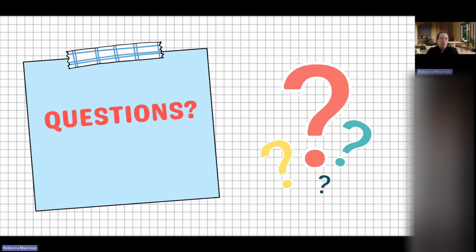Okay. Does that make sense? Yes, thank you. I know sometimes the doctor asks, what is QTC? It's like, oh, that is important. So usually if you have both, you can just document the QTC, you can kind of skip the QT. I mean, it's not wrong to document both. But when you're reporting to your physician, usually you want to give them the QTC because that's going to be the more accurate number. Okay. Thank you very much.